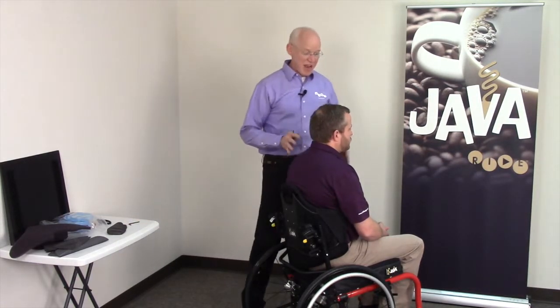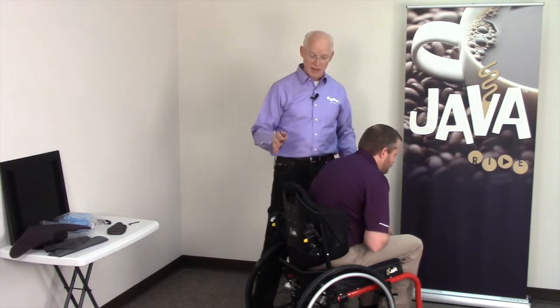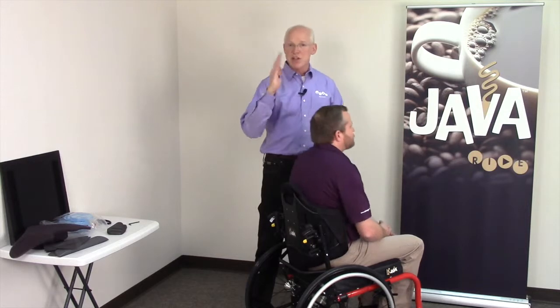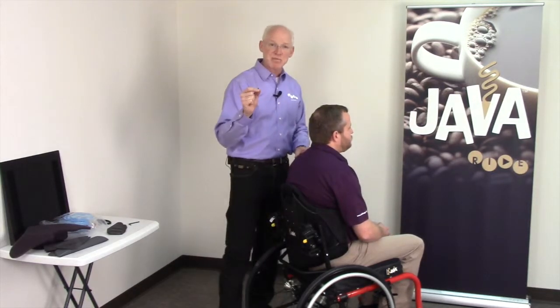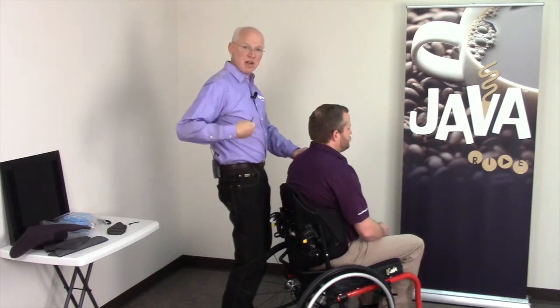And we're going to say right now, when Ryan takes a breath and relaxes, what happens? He just kind of falls forward out of there. So what I need to be able to do is adjust that back angle now for balance. A good back support will recognize the biomechanical principles of balance relative to the pelvis and trunk.